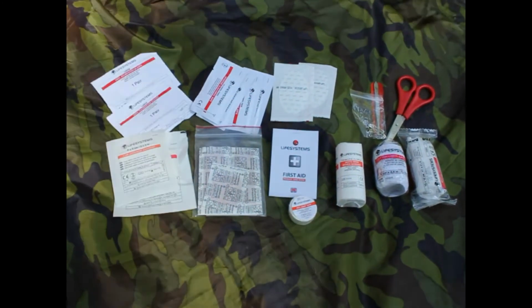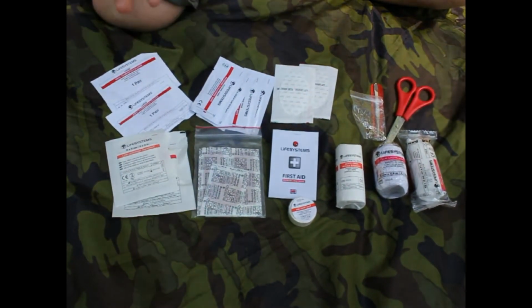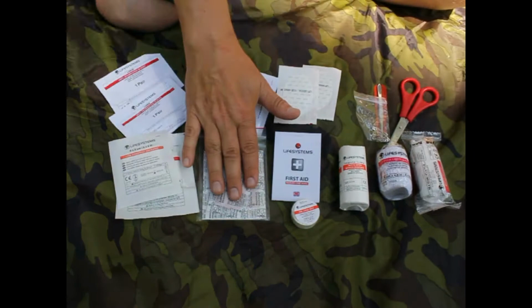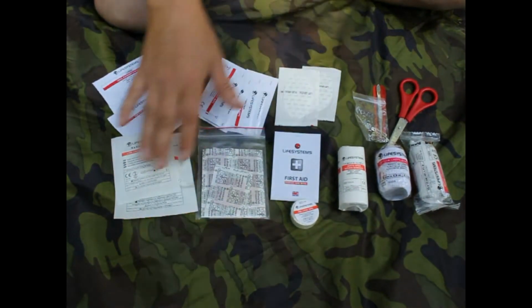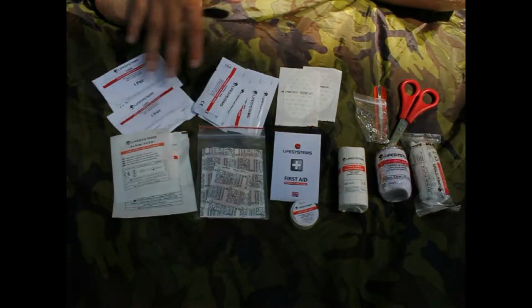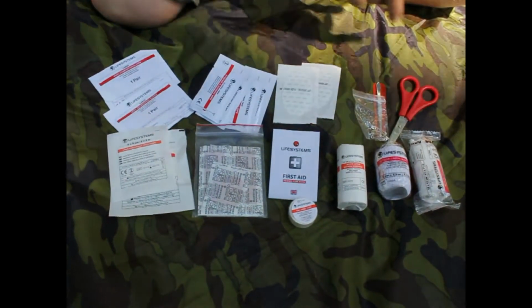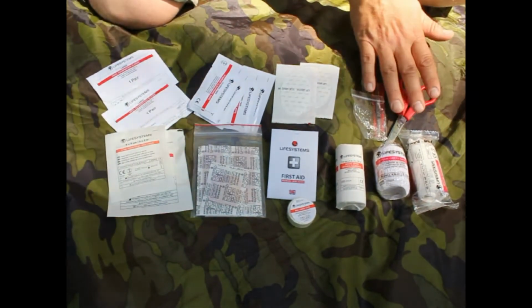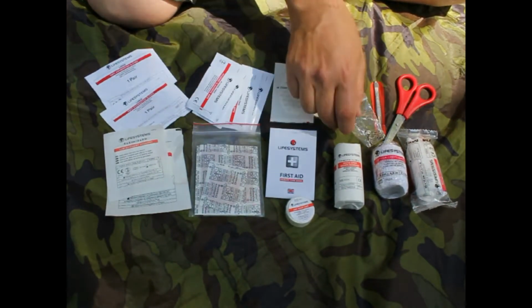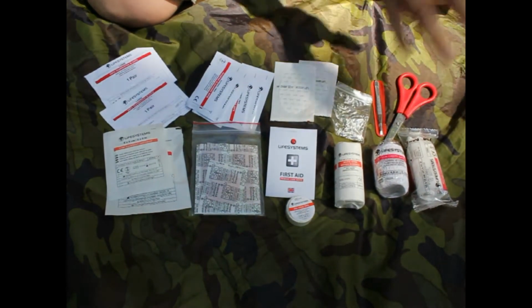So what is this first aid kit for? Now you can see that it has most all the things for smaller wounds. You have a nice variety of bandages of different kinds and sizes for wounds. So we are covered here. We have a lot in hygiene. We have both gloves and hygienic wipes here. We have scissors for cutting up clothes or what you need. We have tweezers here for foreign objects, and we have a small variety of larger bandages for sprains and broken parts.